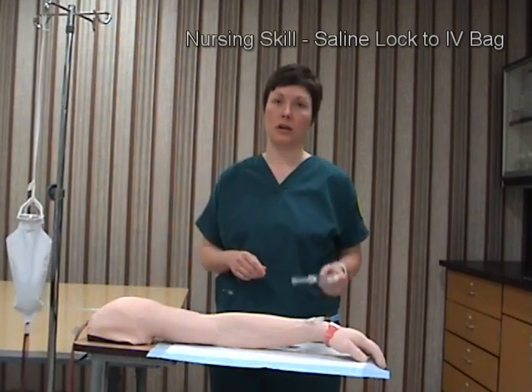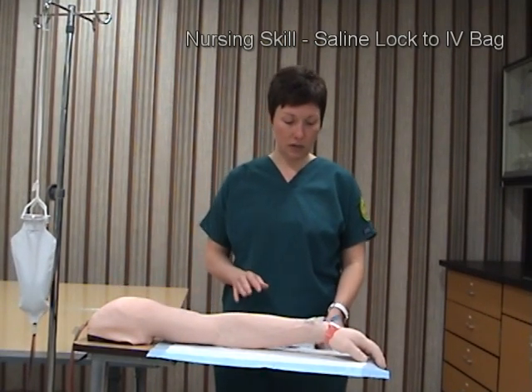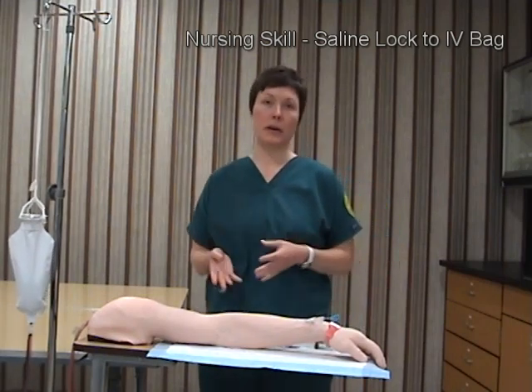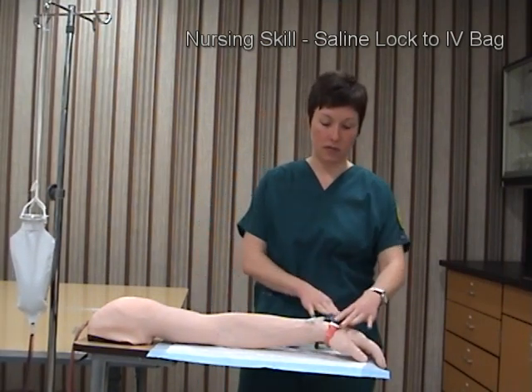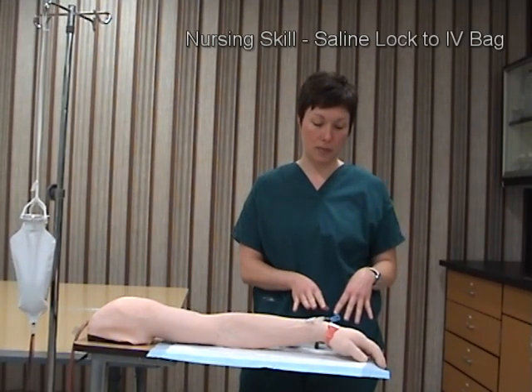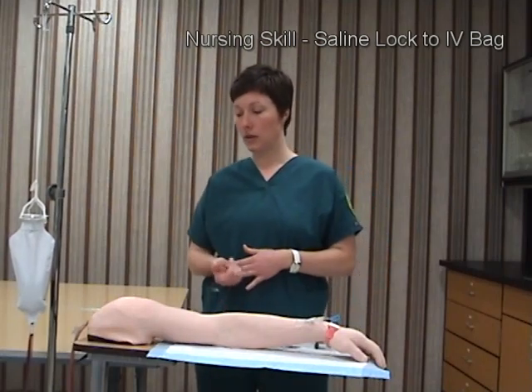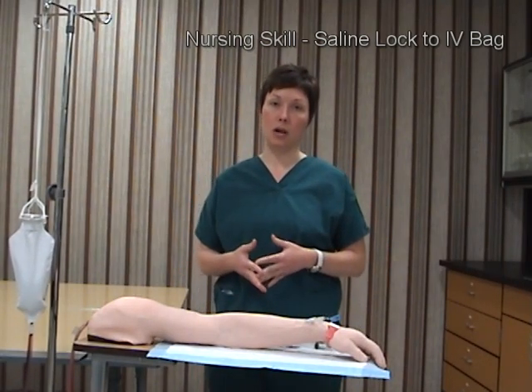Today I'm going to be converting a saline lock to an IV bag. The first thing I will do is verify my doctor's orders. I will come into the patient room, verify that I have the correct patient by having them confirm their name and date of birth, and explain the procedure that I'm going to be doing to the patient.